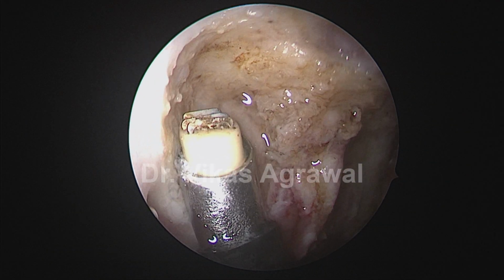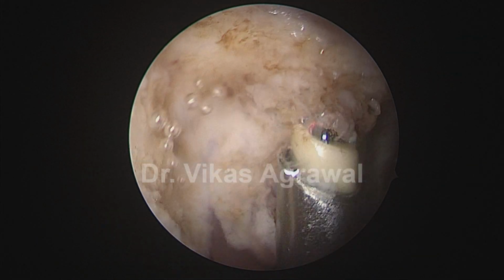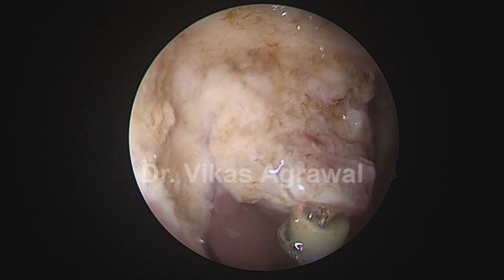I'll not open up the periosteum, but remove the lymphoid tissues completely below the periosteum.